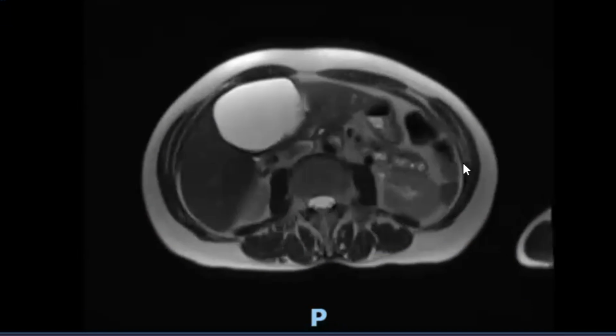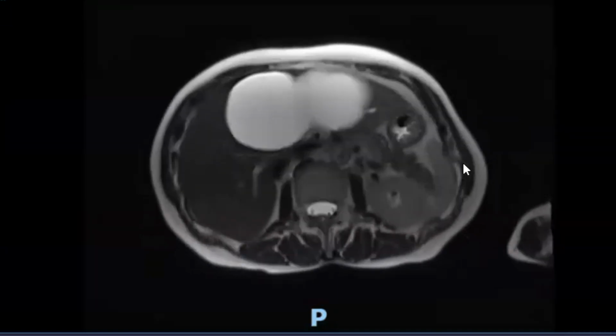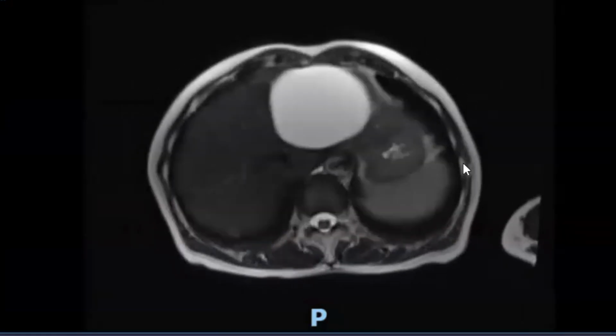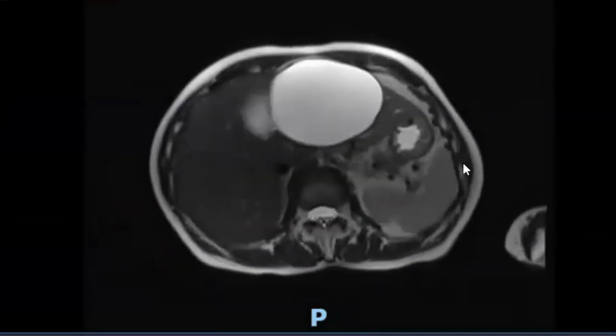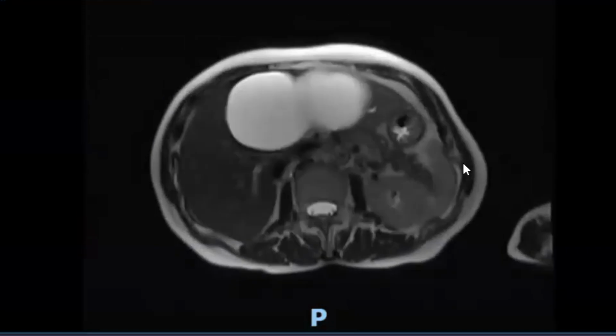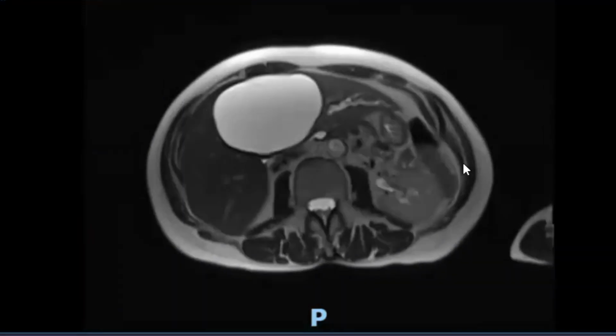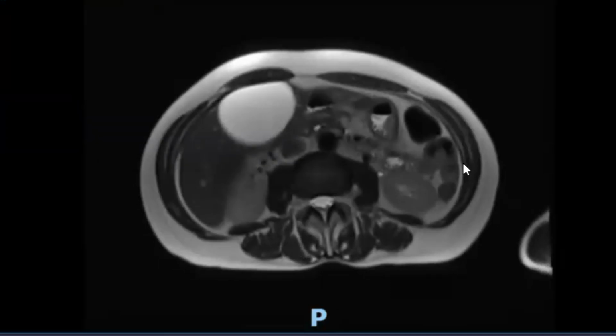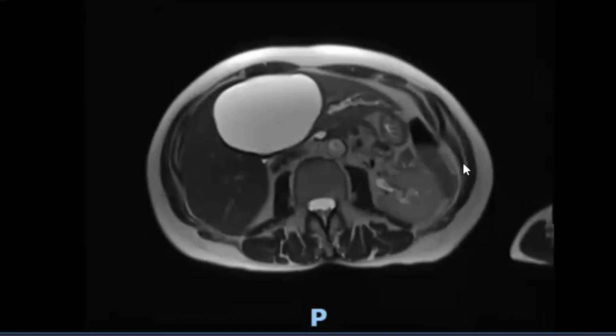Yes. So this is the CT scan that appeared to us, the MRI that was shown to us. You see a big cyst in the left liver and a smaller cyst more central. What attracted our attention is this dilatation of the bile ducts here.